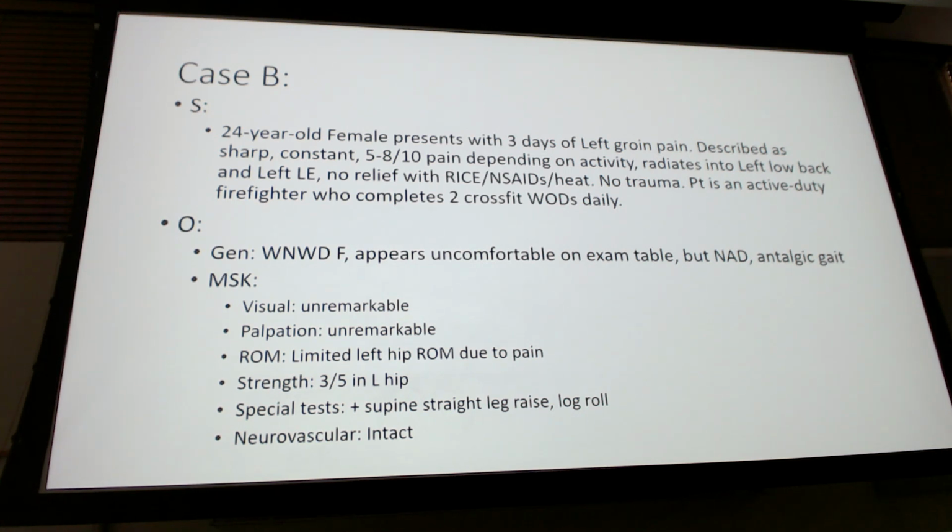So it depends on what you're looking for, right? If you're concerned about the hip in general, remember we talked about the joint above and the joint below when you're trying to evaluate an entire bone. So with a femur X-ray, you have to have joint above and joint below because you're not seeing the whole femur. If you're convinced based off of your physical exam and the symptoms that it's within the hip area, you don't need the knee because you're just checking out the hip, right? So just to answer that question.